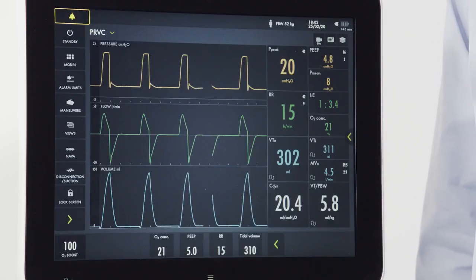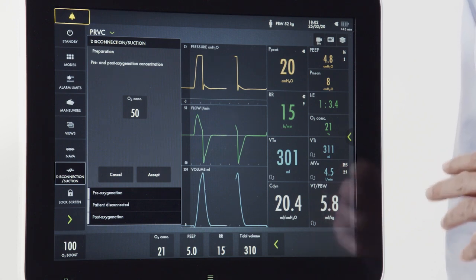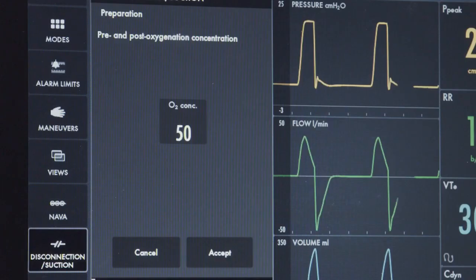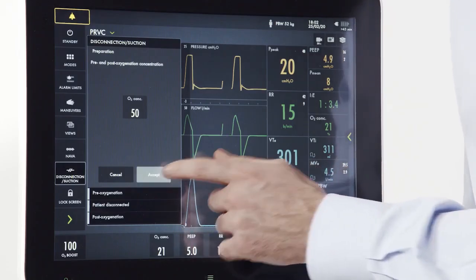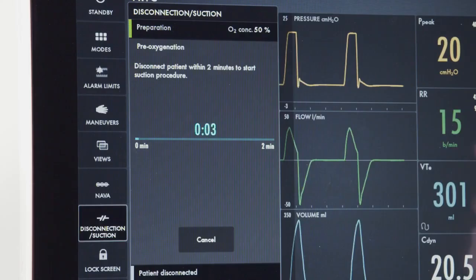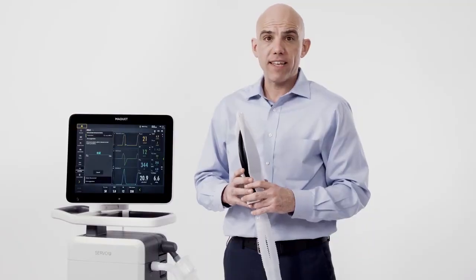The disconnection suction feature can be utilized for a brief disconnection from the ventilator. During the disconnection, the ventilator will not alarm or cycle for a period of one minute when disconnection is enabled. To go through the maneuver, first push the disconnection suction button. There are four steps: the first is preparation, where we can set an oxygen level for pre and post oxygenation. Once I hit accept, I begin pre-oxygenation — a two-minute period where I have a window to begin my disconnection maneuver.